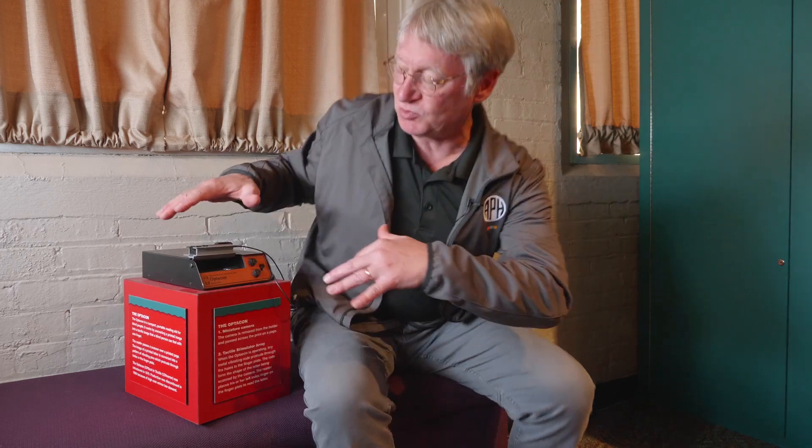People who became good at using the Optacon really loved it because it was one of the first devices that gave you total independence. You were in control of converting whatever was out there in print into a form that you could read. People loved that and became very good at using the Optacon to quickly read.